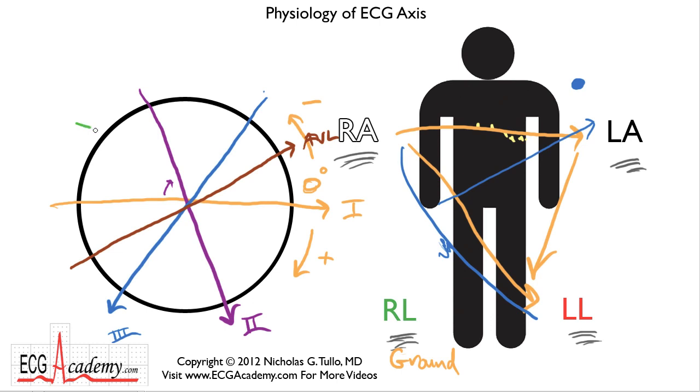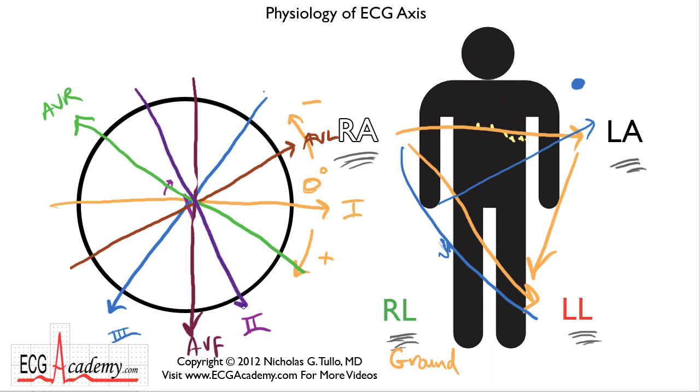Likewise, AVR is 30 degrees above the horizontal, but pointing towards the right arm. And finally, AVF is basically pointing towards the feet. Well, I had to just fix my lead 2 a little bit to make it look prettier. But that's basically the whole circle.